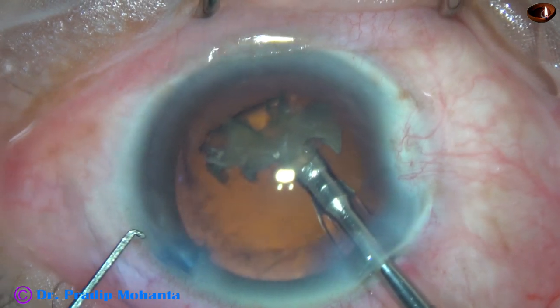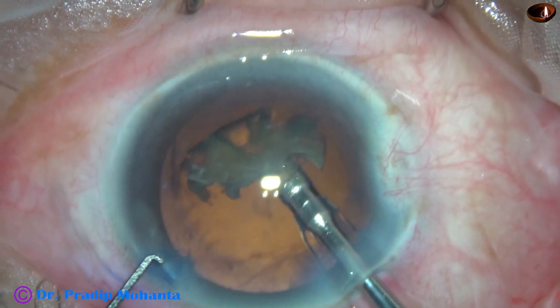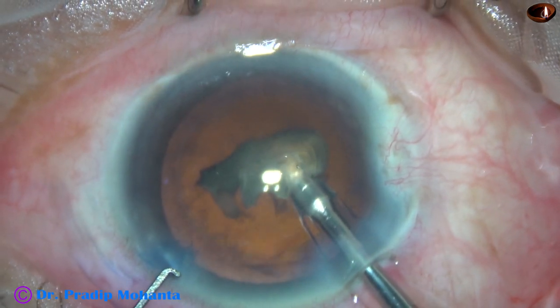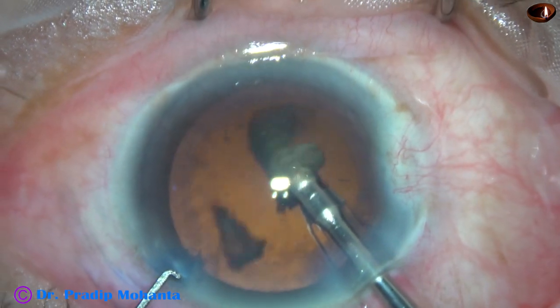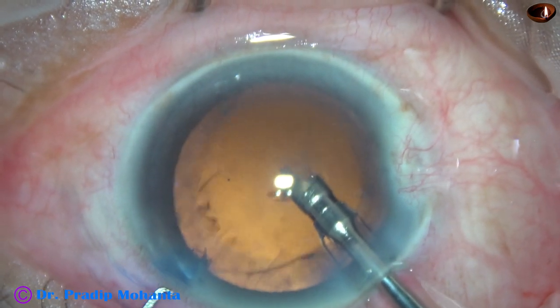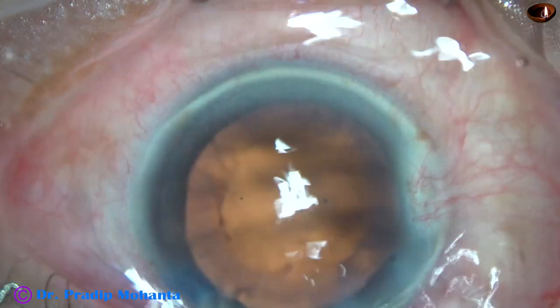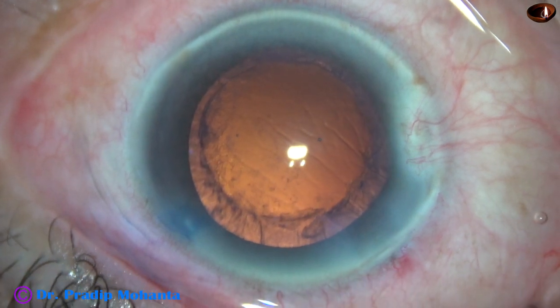For this last small piece, I ask my assistant to switch to FECO-ON mode where the vacuum is only 80 mmHg, flow rate is 20ml/min, and ultrasonic energy is 60%. This is because I want a more stable anterior chamber during emulsification of the last piece.